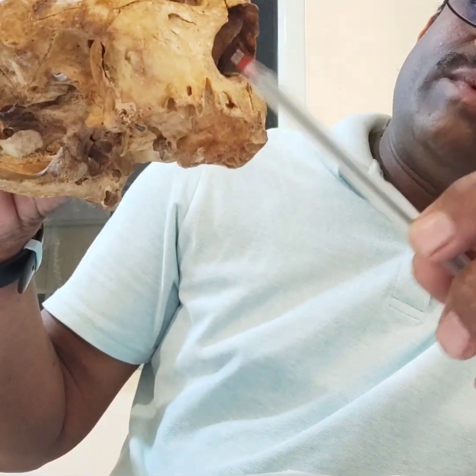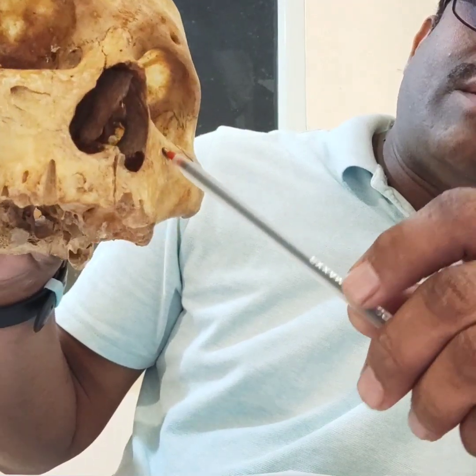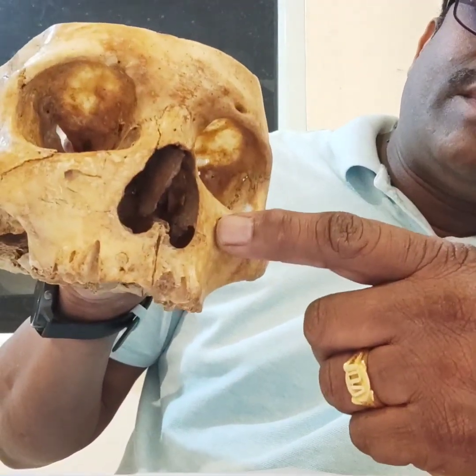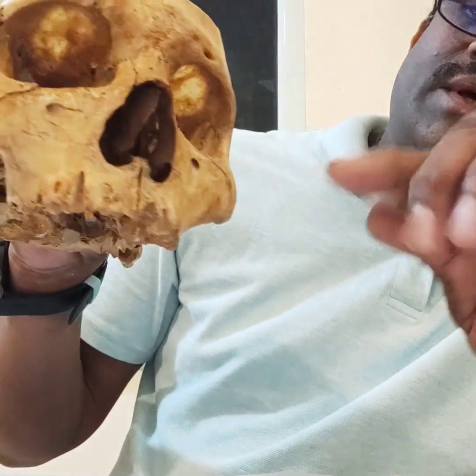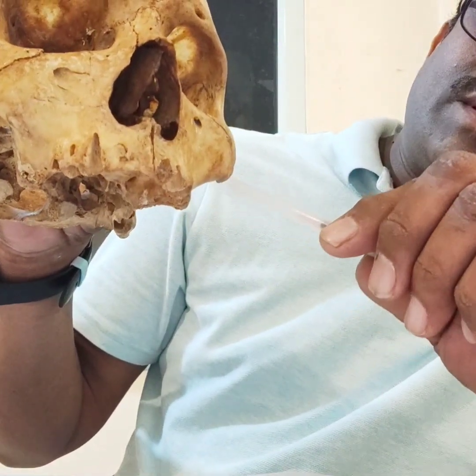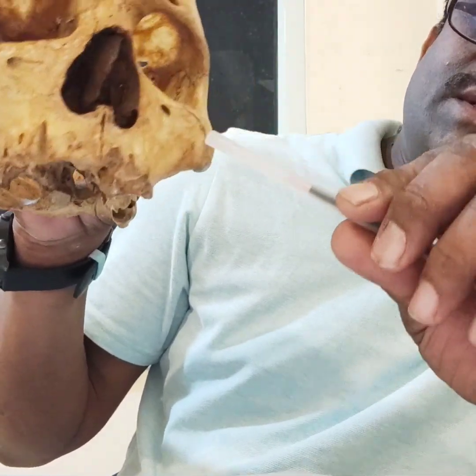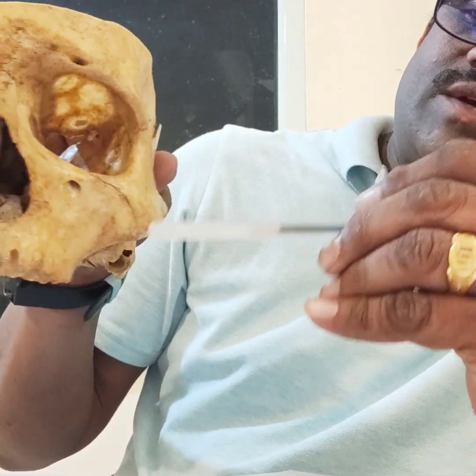While placing the zygomatic implants, the anatomical structure of importance is the infraorbital foramen. This is the infraorbital foramen. Usually the zygomatic implants will be placed angulated, from the first premolar or second premolar area, angulated towards the buttress. This is the buttress of the zygomatic bone.